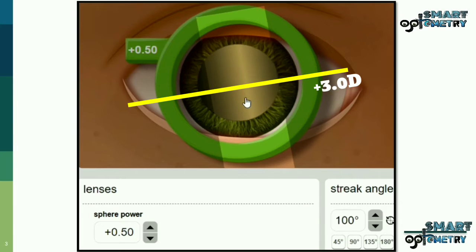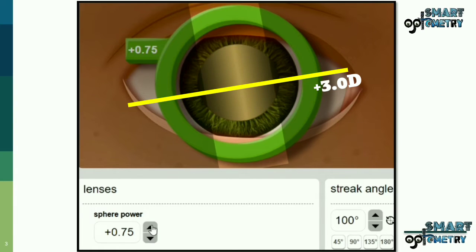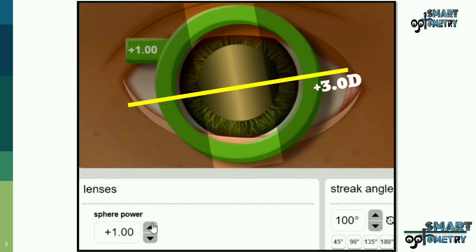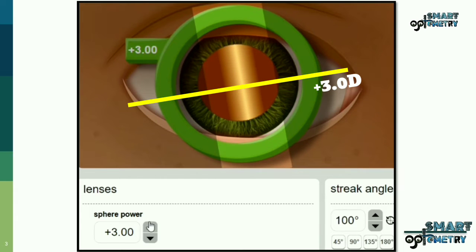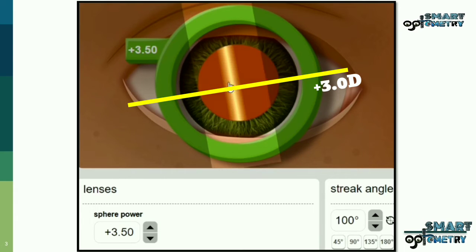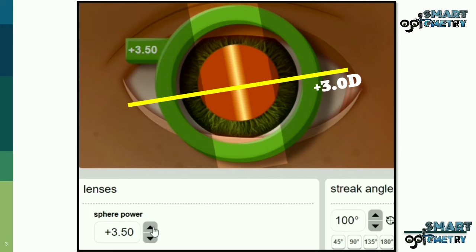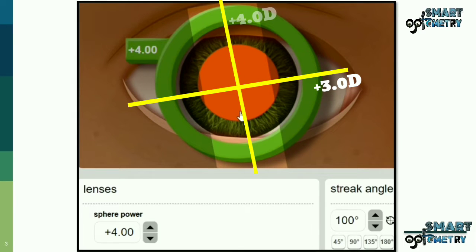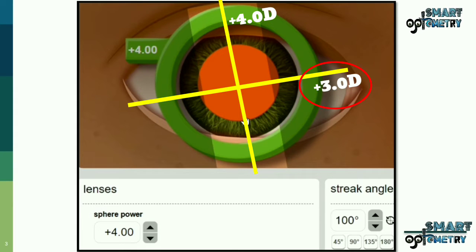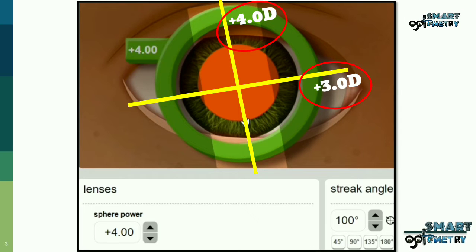With plus 0.5, still with movement. With plus 1, still with. With plus 2, still with. With plus 3, still with. With plus 3.5, still with movement. Finally, with plus 4, this meridian is neutralized. So in this meridian we have plus 4. So in our 10-degree meridian we had plus 3, and in the 100-degree meridian we have plus 4.